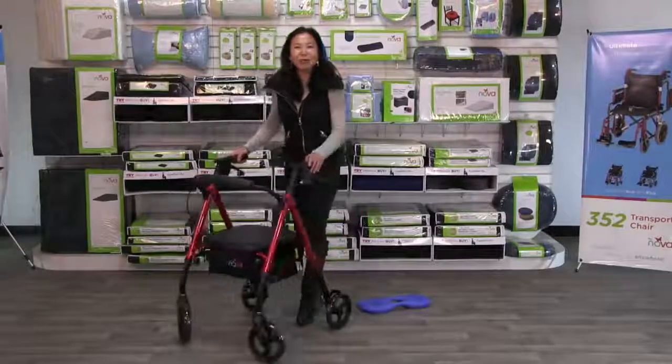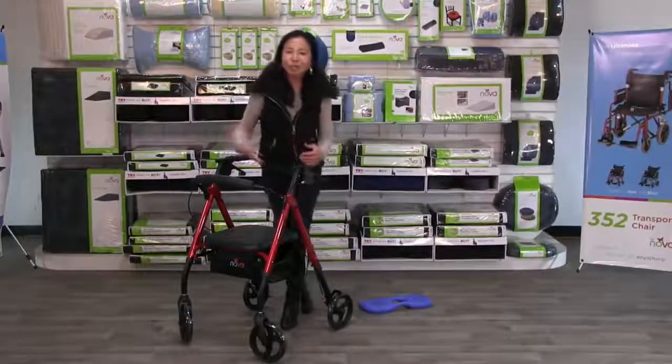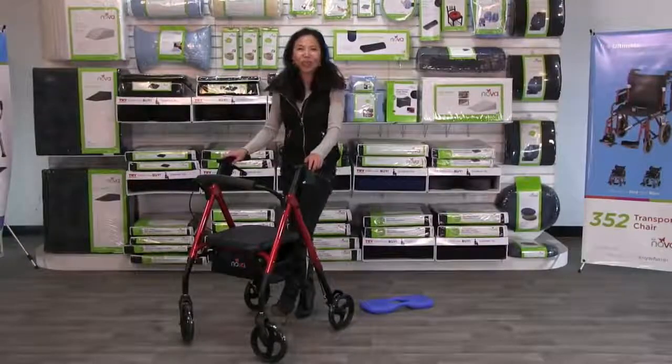There you go — the Star 8: so easy to put together, so easy to adjust, and so great for your life.